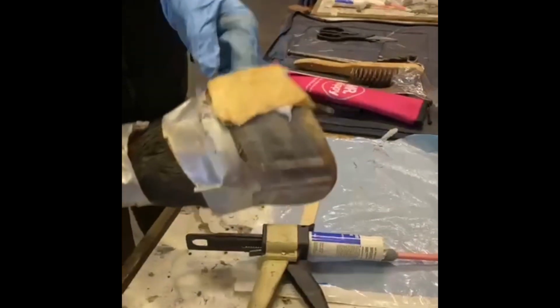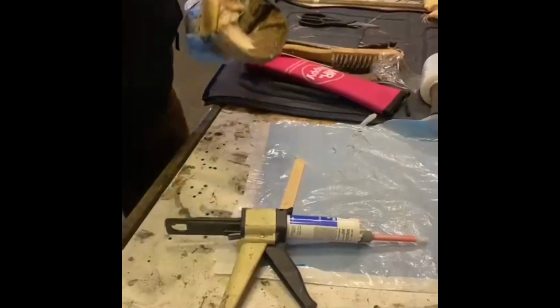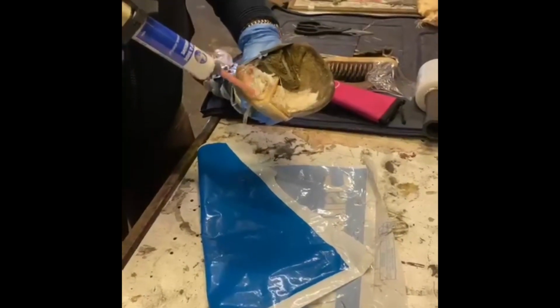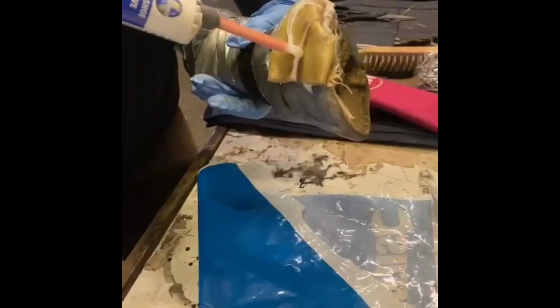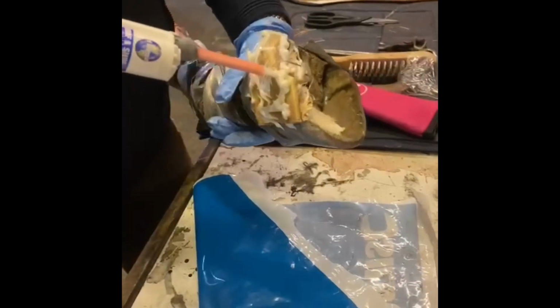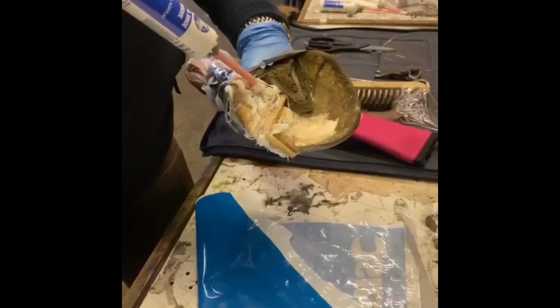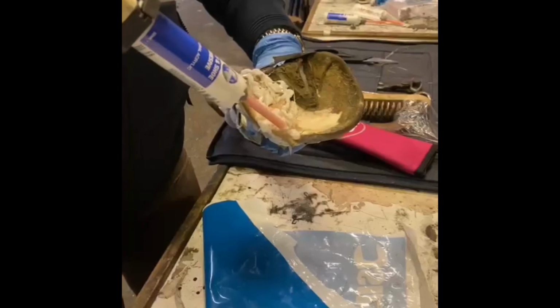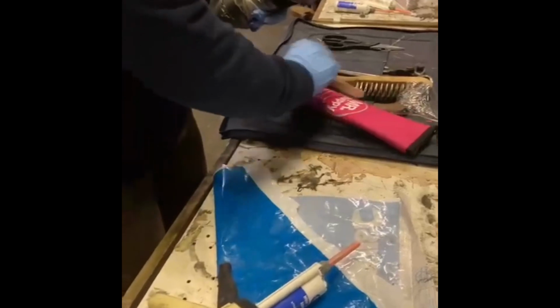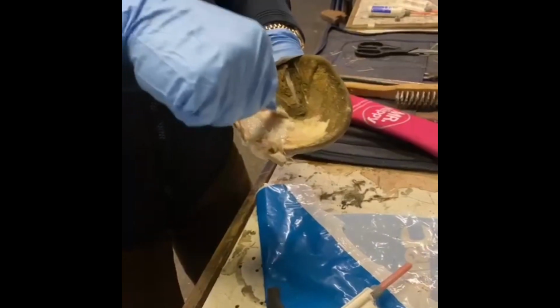and then we can put, if you get any of these strandy bits, it doesn't matter, just incorporate them into the patch. A bit of glue all over, so we'll get a really nice finish. And then smooth that a little bit, try and push that down.